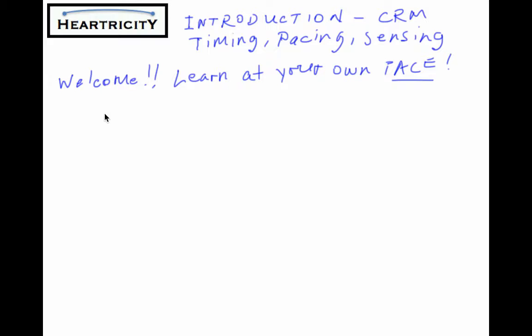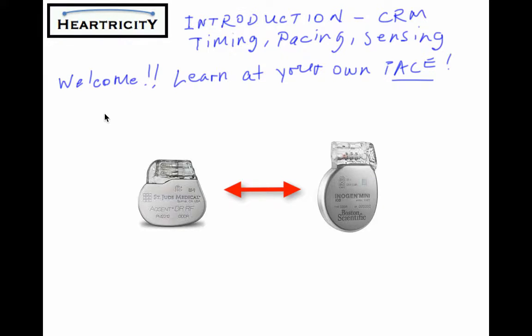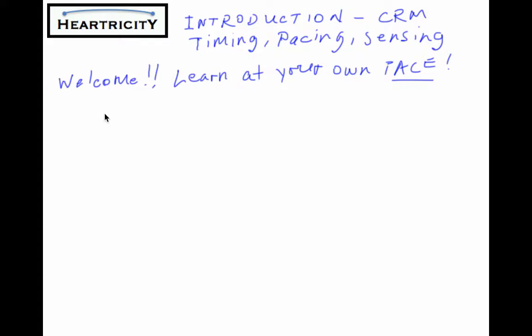Now, in this video and future concept videos, when I say pacemaker, just assume that the concept I'm talking about is applicable to ICDs as well, unless noted otherwise. In future videos, we'll talk about the things specific to ICDs, such as shock therapy and other differences compared to pacemakers, but that will be down the road.